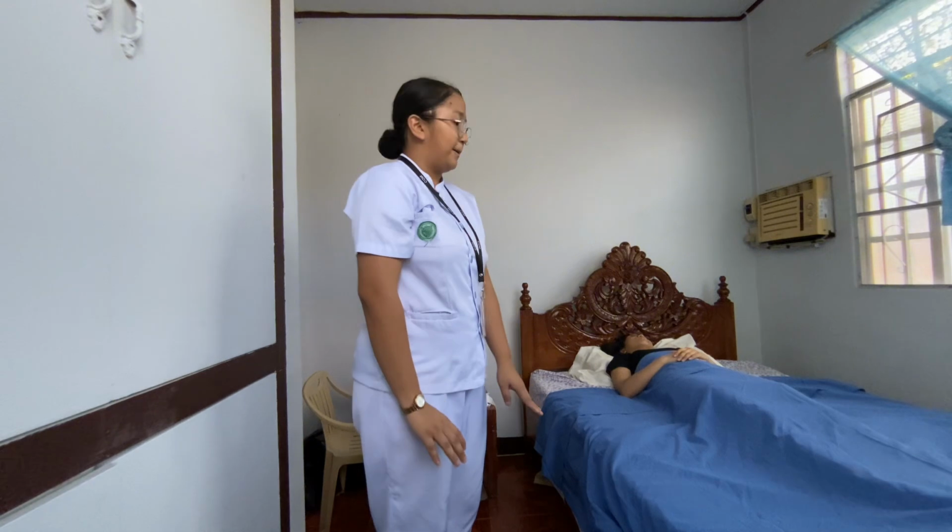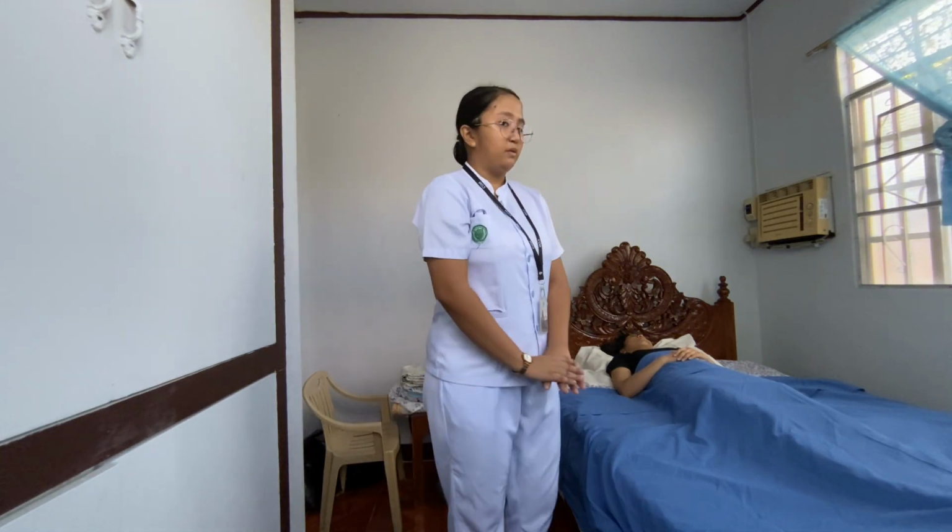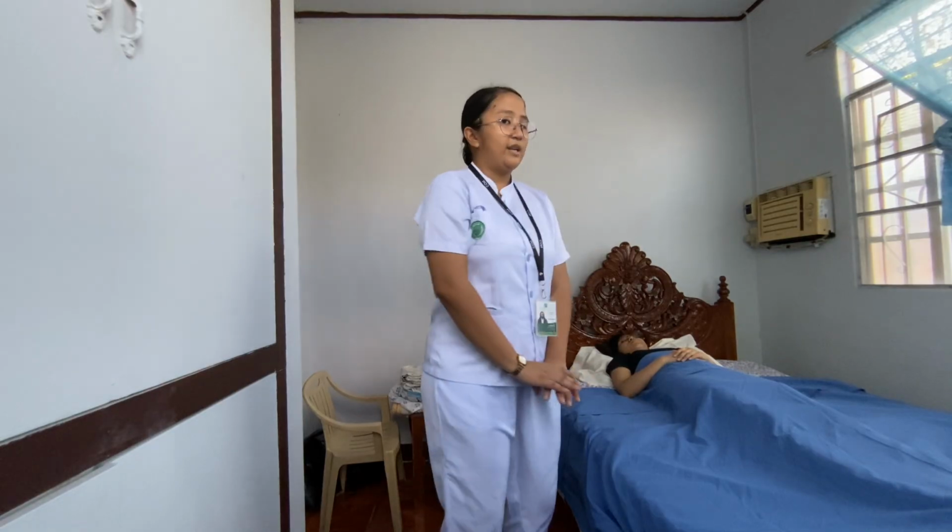So, next naman po is I'm going to adjust the bed to the comfortable working height, usually elbow po height of the caregiver. But since hindi po siya namumove, naka-position na rin po si client, in-adjust ko na rin po yung bed niya. Hindi po kasi namumove yung pataas yung bed, so kailangan lang po yung gagawin po natin.